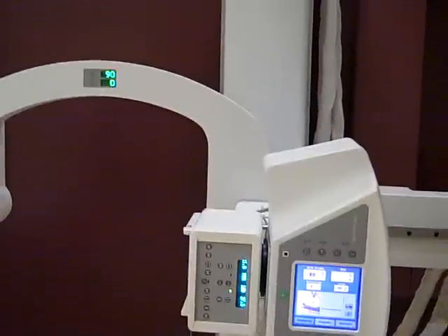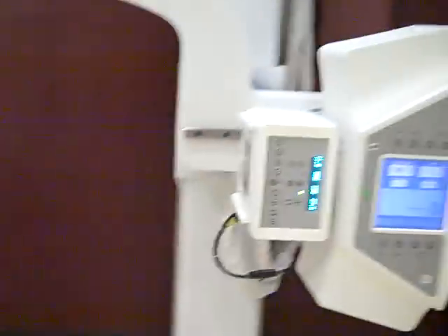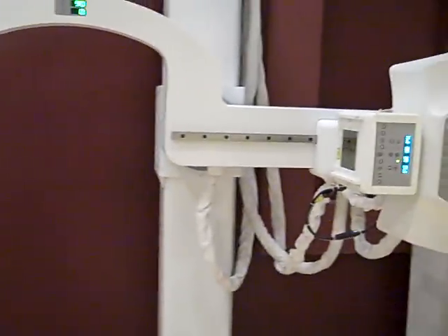We have full range of motion so it tilts at the touch of a button. It sets up automatically for chest x-rays.